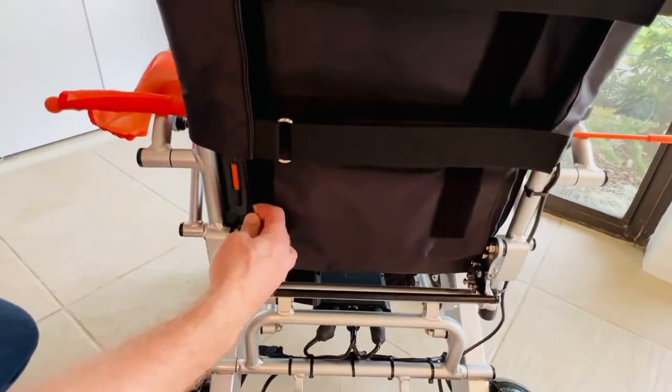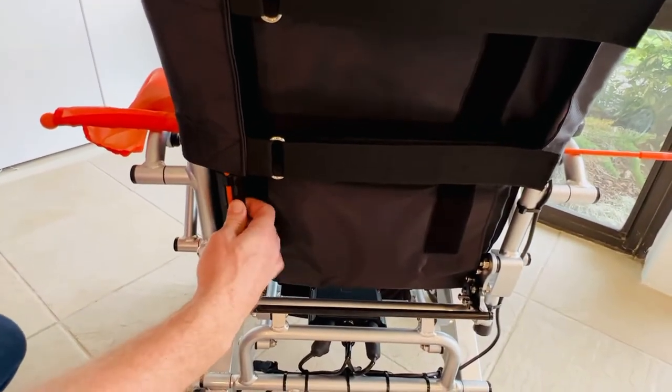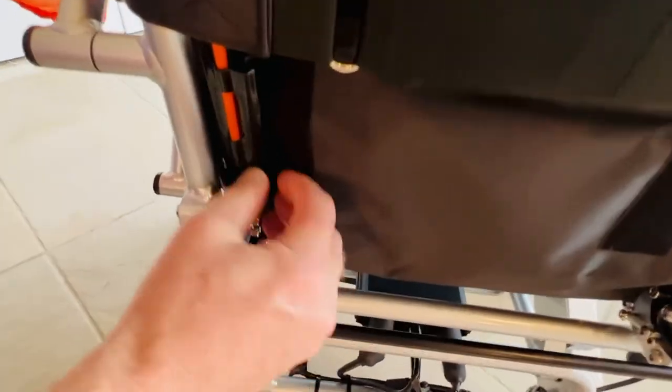I'm going to thread this directly through and you can see that this nodule just kind of hugs the chair itself.